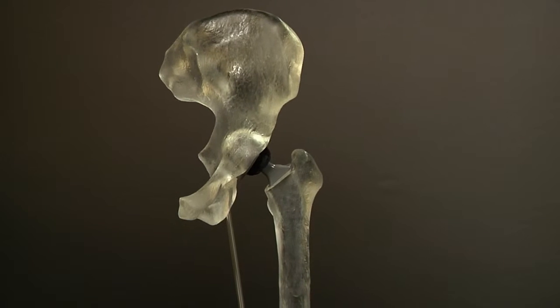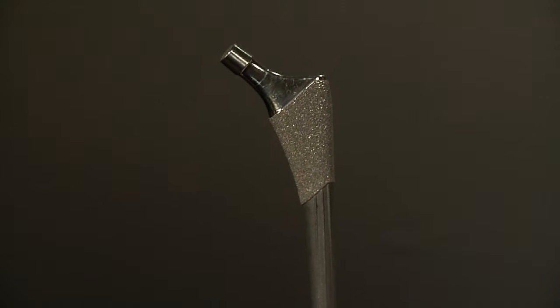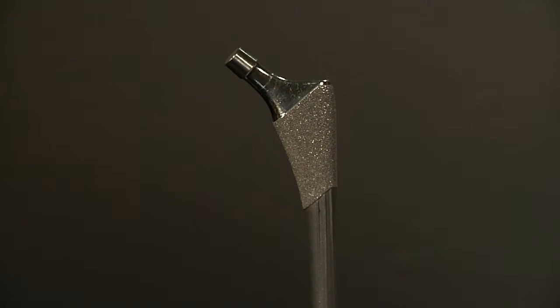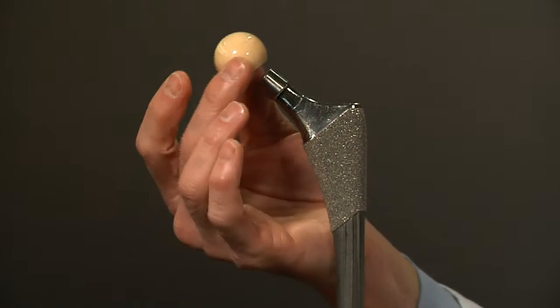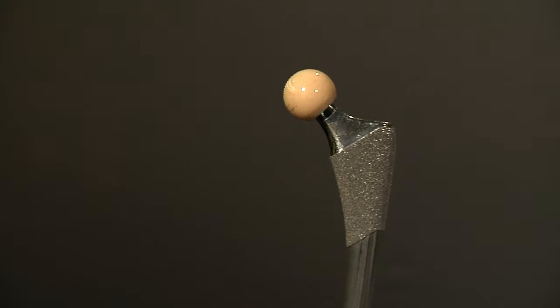This is an example of a hip replacement stem, or the portion of the joint replacement that goes in the thigh bone. On the top of the stem, a ball of various size and thickness is placed.